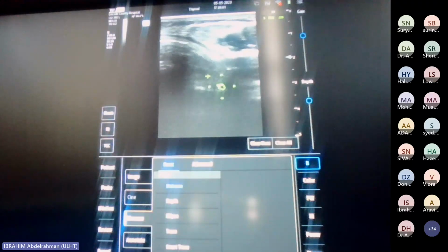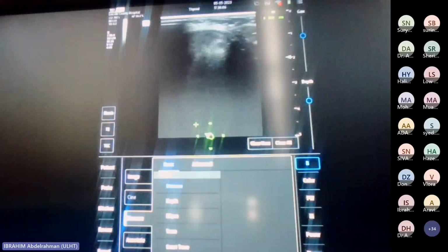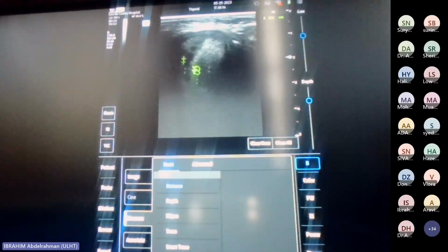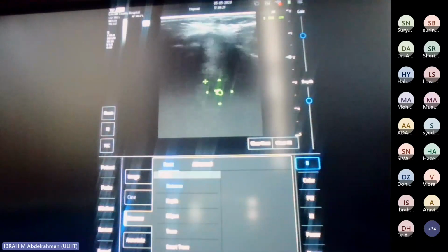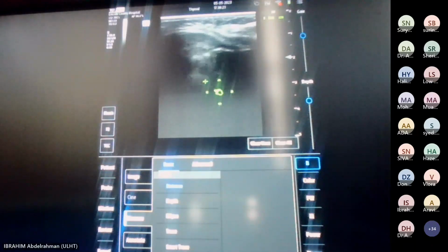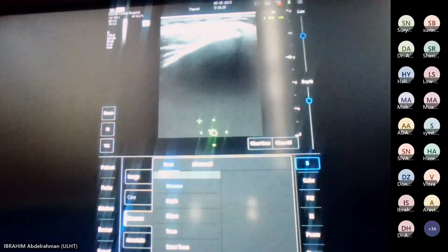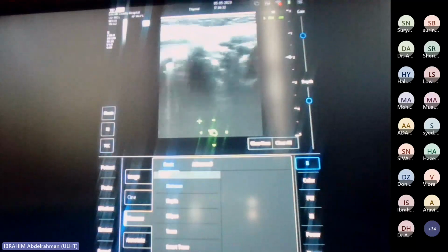And then just put your tongue on the side of your cheek for me. We can also see the tongue quite clearly through the cheek. So you can just see the midline raphe there. There we go, a midline raphe through the tongue. So if there was a lesion on the tip of the tongue or on the lateral border, you can sometimes see that on ultrasound. That is a bit of a whistle-stop tour through the anatomy of the neck.